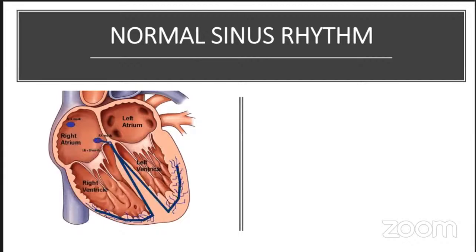So again, hopefully I'll make out time and we can continue and we'll look at normal sinus rhythm. Once we're able to identify what the normal is, we can go forward to identify all those abnormal rhythms and how we can manage them.